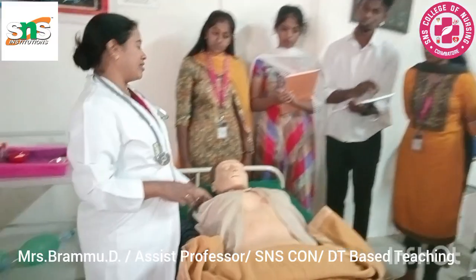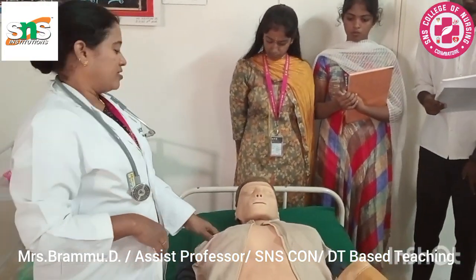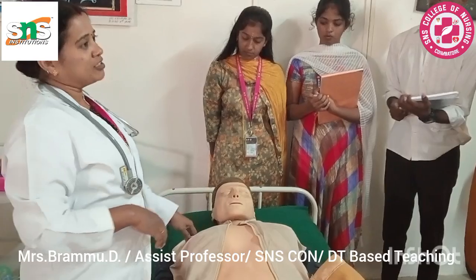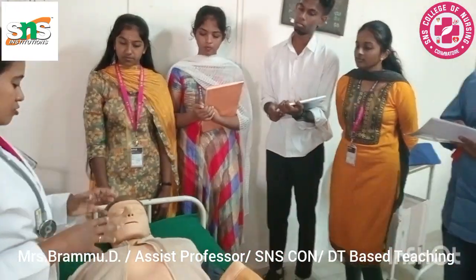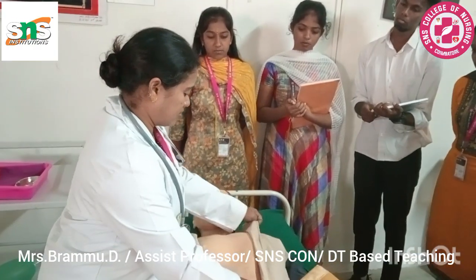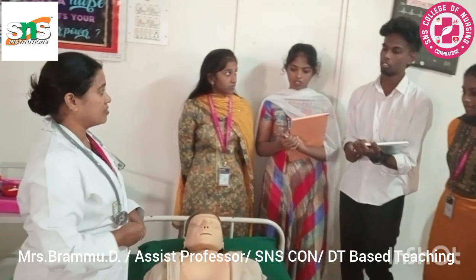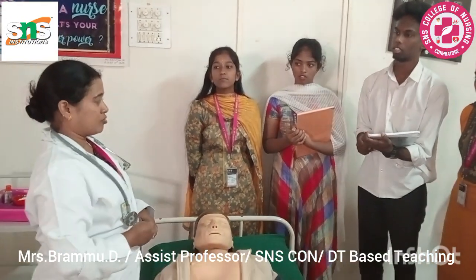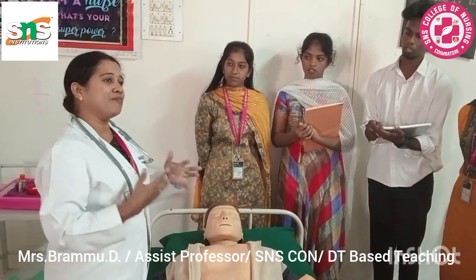So here we have Mr. Roy as our client today. He has come with some palpitation, so we are going to do some auscultation of the heart. We all know where the heart is situated. Yes, Sam, can you please say where it is situated? In between the intercostal space, you say. We can't say blindly like that.